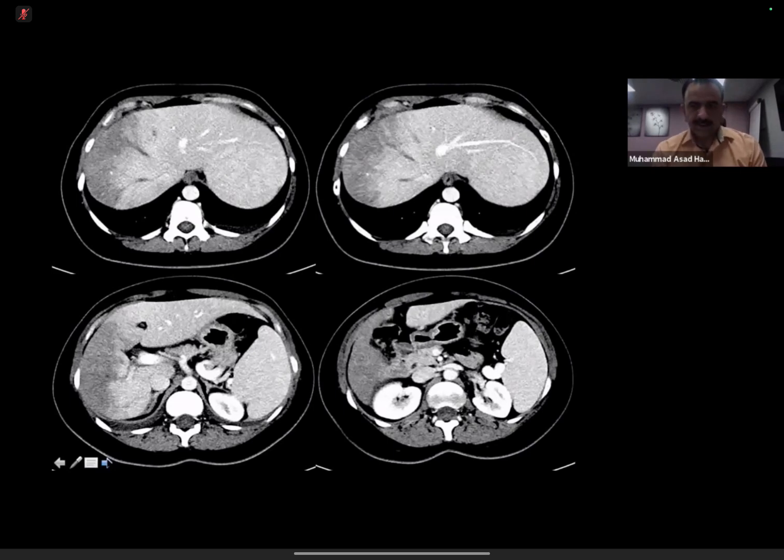Okay, sorry. Now, you have described it very well that the visualized portal vein is looking well. You have described that there is a bit of irregular enhancement of the part of the right lobe of the liver. Once you notice such things, the next thing is, can you see the hepatic vein?